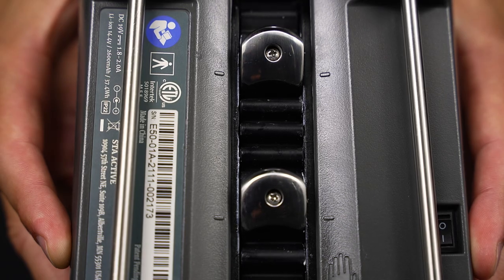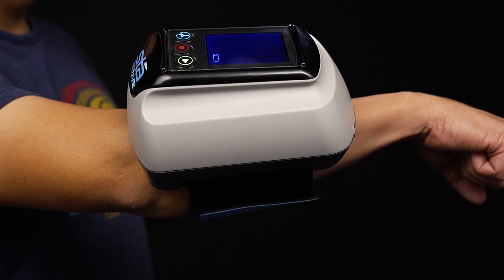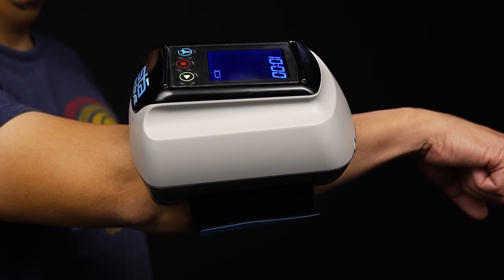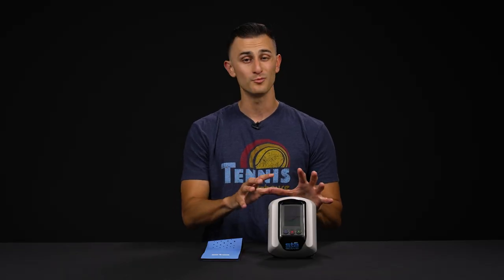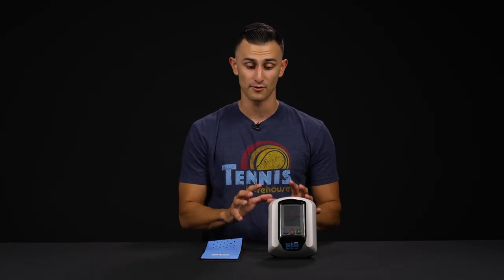What I noticed after the day I used the device was a little bit of soreness in my arm for the first couple of weeks, and that's just part of that rehab and healing process. So don't be alarmed if you do feel a little bit of that discomfort — that's part of the deal.